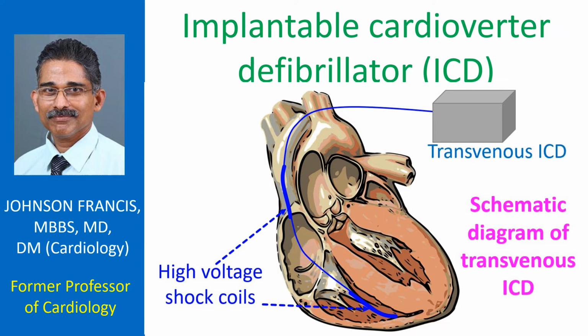When Michael Mirowski reported on a standby automatic defibrillator in 1970, it was met with a lot of skepticism. But now, ICD is time-tested, life-saving equipment.